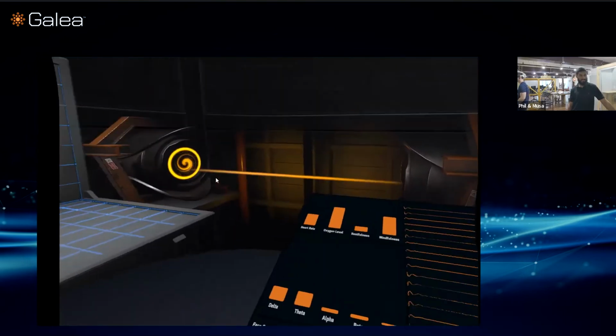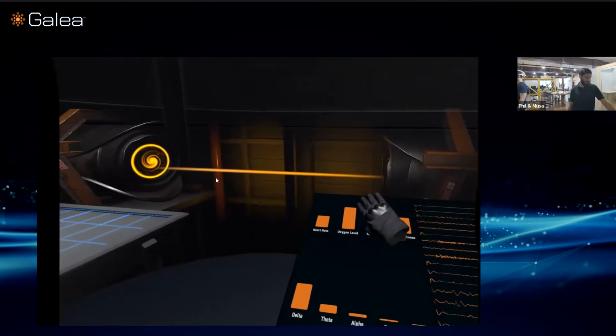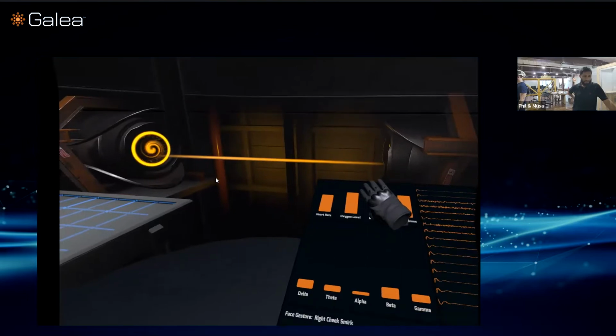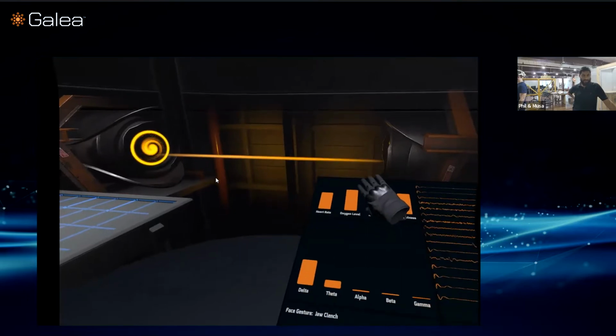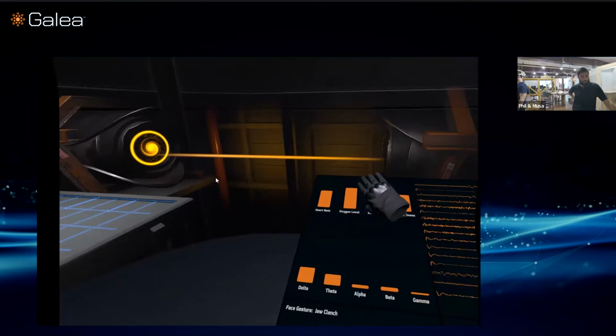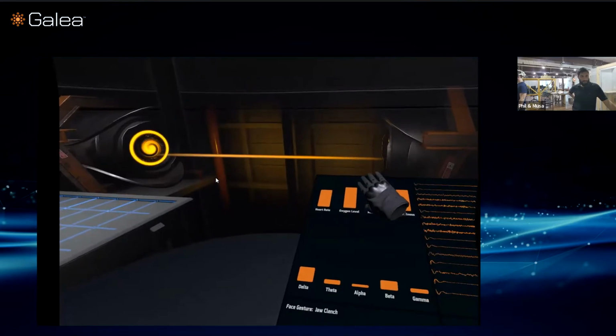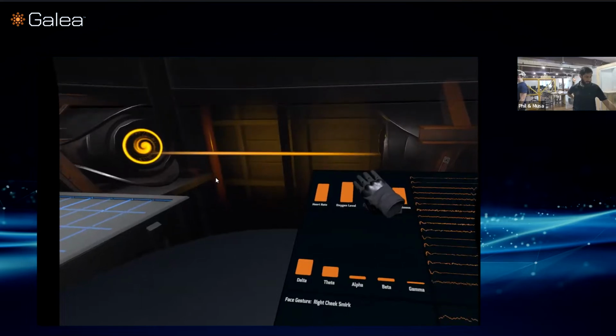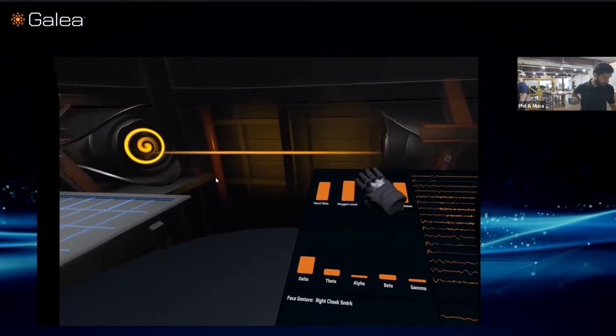All right, so now he stopped holding his breath. So you'll see it go back up. You can see the heart rate going pretty quickly back to 70. You can see the oxygen level moving too now. Yeah, it recovered like 5 to 10%.